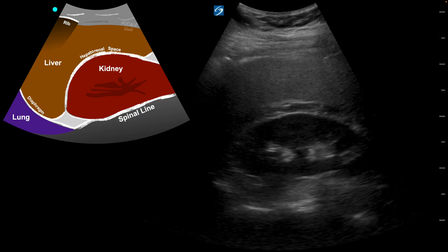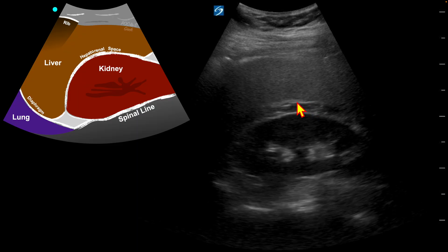What was your question on this image? We have a drawing here and then we have your image you obtained. When I looked, I could see this space in between the kidney and the liver, and I was wondering if that would constitute a positive FAST.